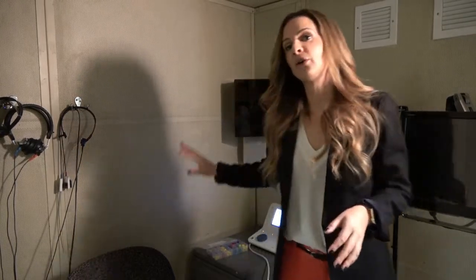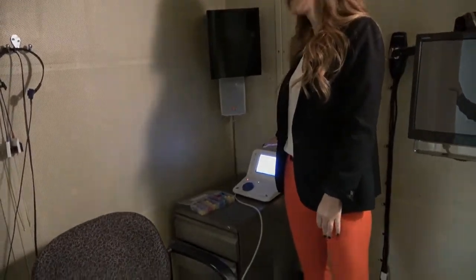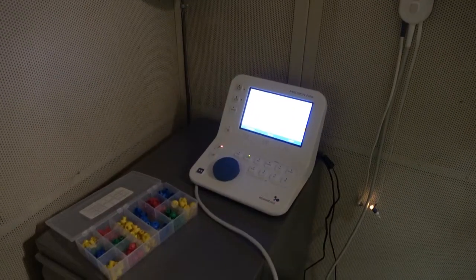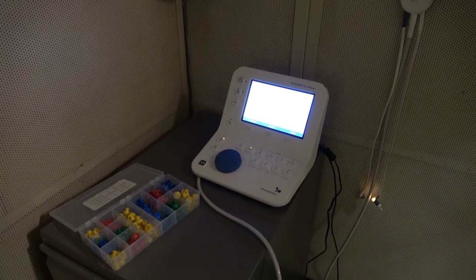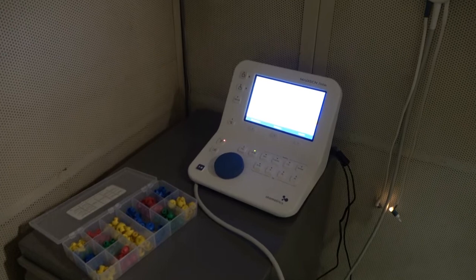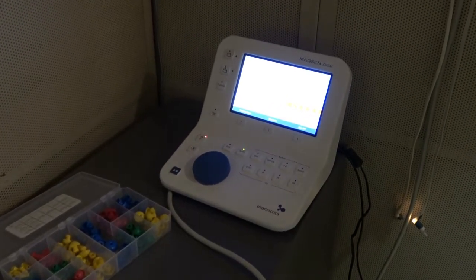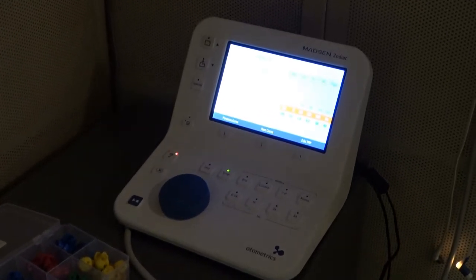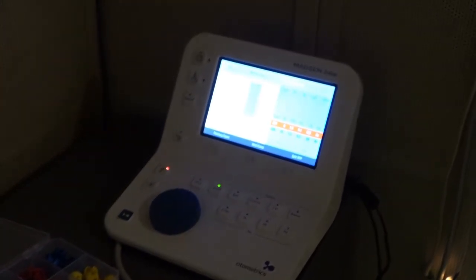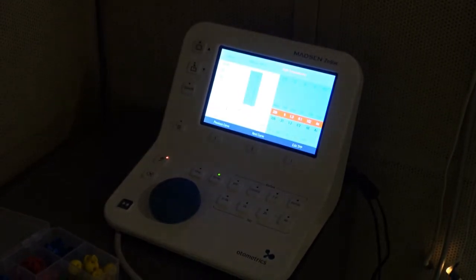After that, we'll go to this first machine right here, which is a tympanometer. This machine is going to put a little bit of pressure inside your ears, nothing that's going to be hurtful or harmful, but it's just going to test to make sure that your eardrums are moving nicely. That is to detect any fluid or maybe adhesion of the bones inside the middle ear cavity, so that way we can say, yes, we're going to get accurate results, or no, we need to refer you over to an ear, nose, and throat doctor.